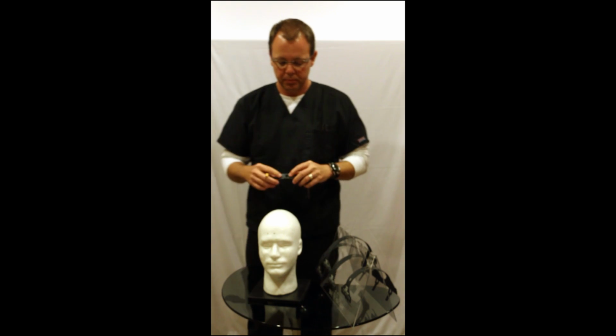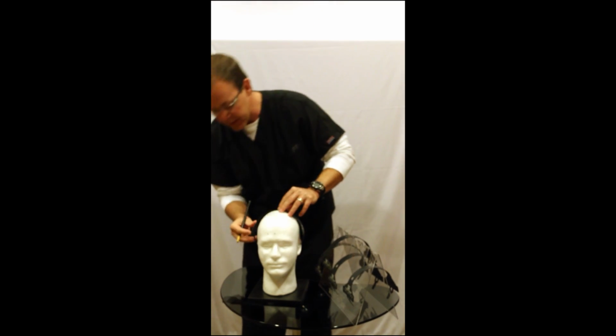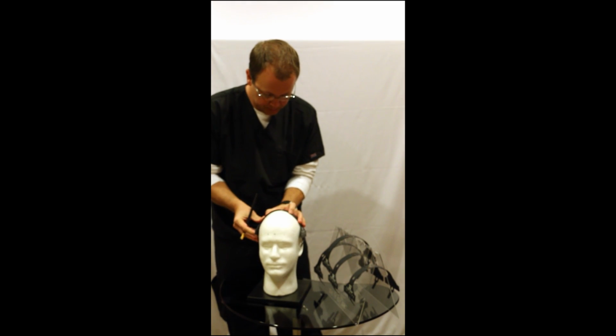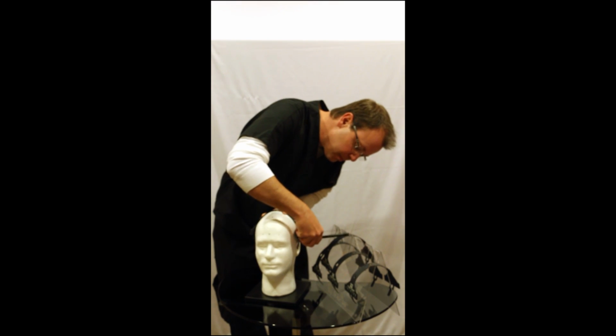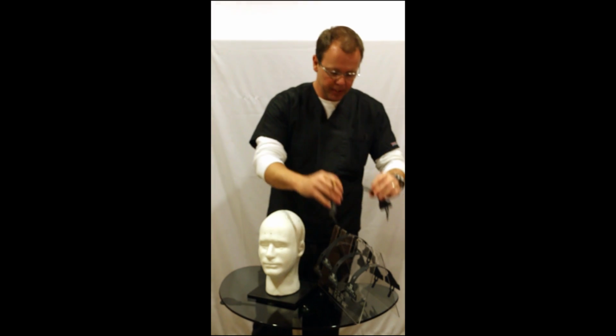Okay, that's that. So now, do my Y line, line up my Z's to my preauriculars. Mark my 20%, 20%, 10%, 10%. Now my Y line is done.